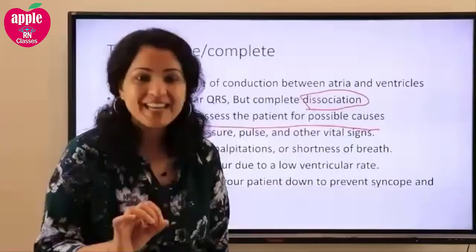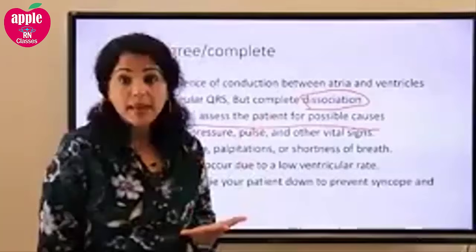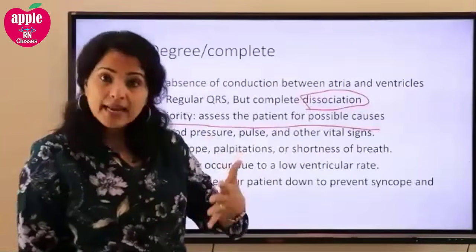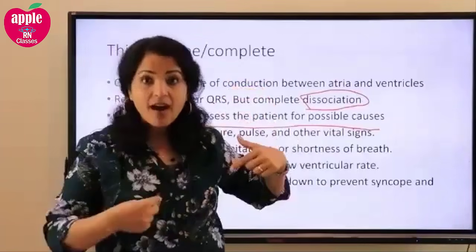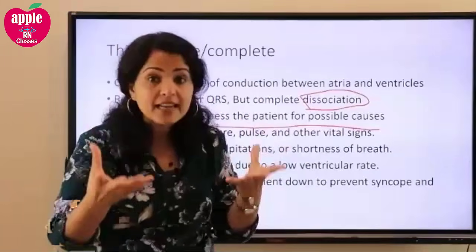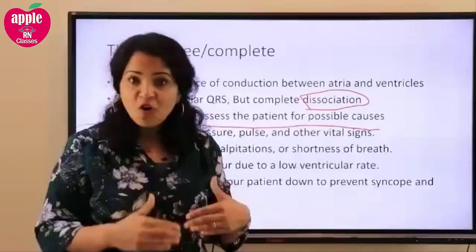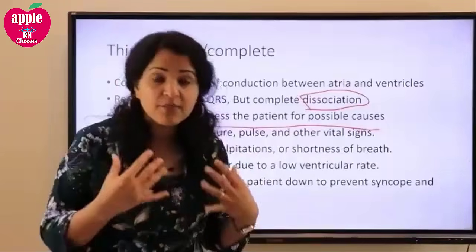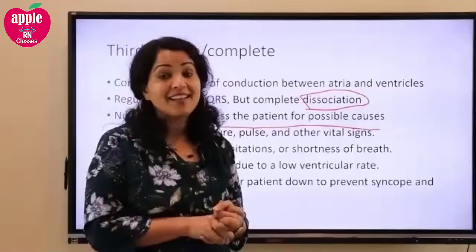That's why we want to give the pacemaker, making sure that things are taken care of. Because if you get the pacemaker, what happens? It will take the work of the SA node. It will help conduct. It will have wires and leads into the heart, into the ventricle. Also, we can give little leads and wires where the electrical impulse can reach. So it is as if the patient is having a normal sinus rhythm. It's as if the patient is having a normal SA node, right? So the pacemaker will really, really help.